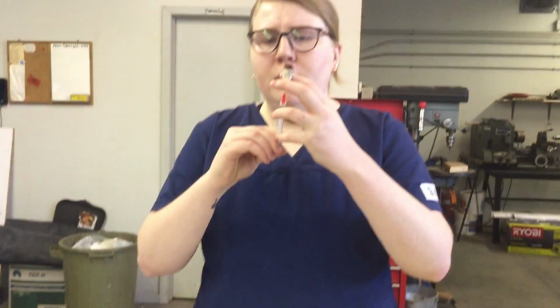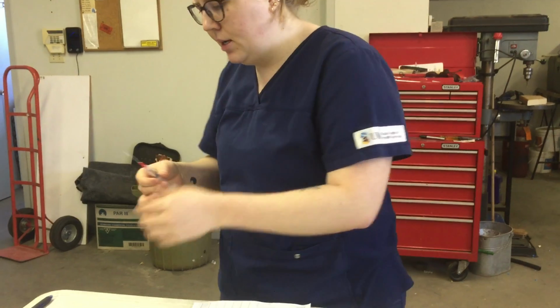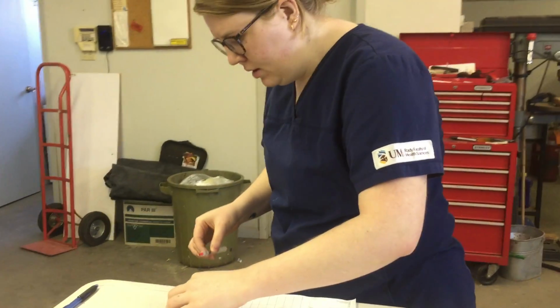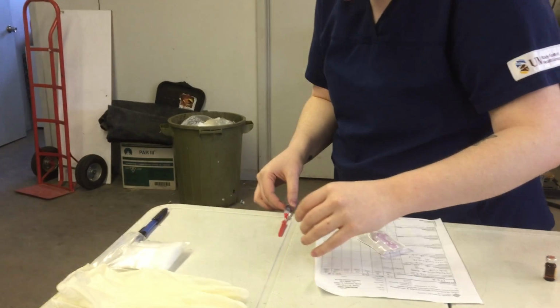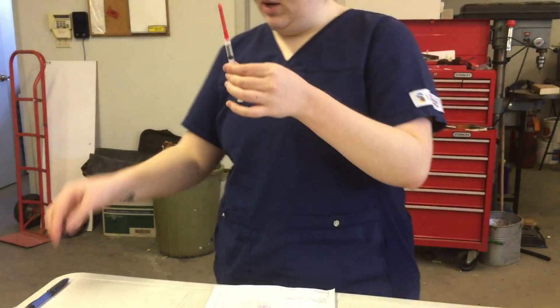Flip this upside down. Just going to let the gravity do the work here. So once I've gotten a little more than 1 ml, just to account for any bubbles, I'm going to take this out and I'm going to recap my needle using the scoop method. Okay, so that's good. And at this point, I'm just going to knock out any bubbles.